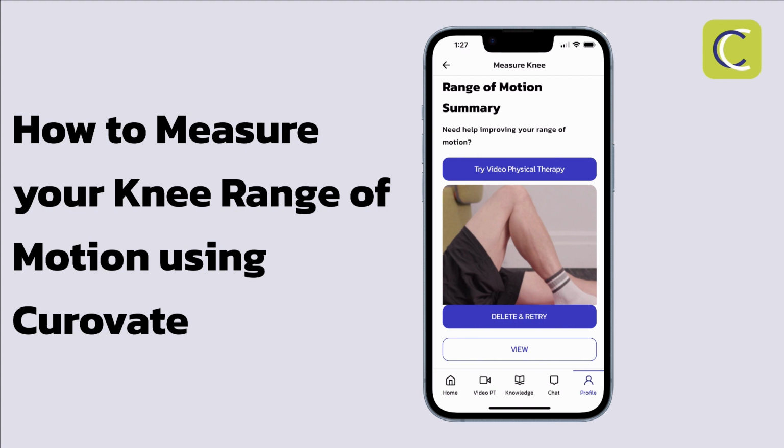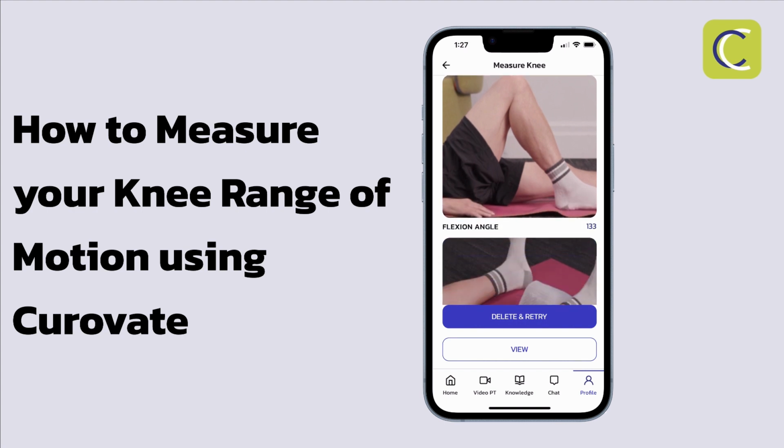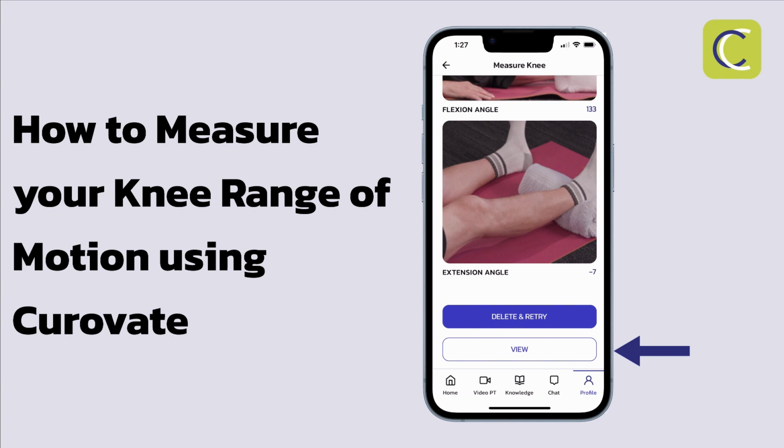Next, you can view the results for your knee bending and knee straightening and select View to save those results.